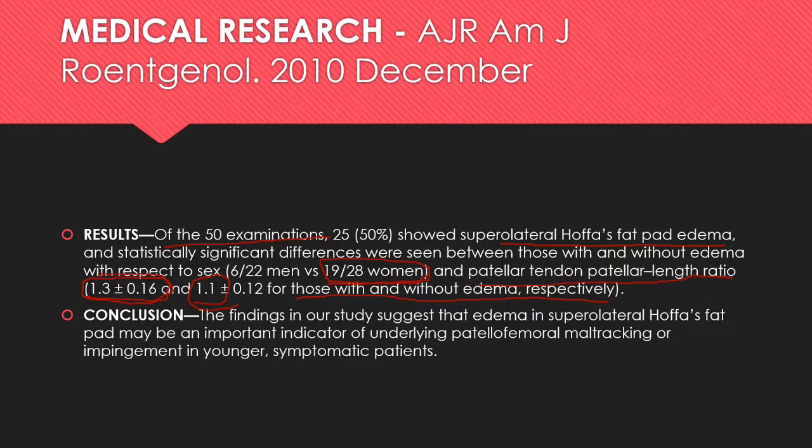And they concluded that the findings in our study suggest that edema in Hoffa's fat pad may be an important indicator of underlying patellofemoral maltracking or impingement in younger symptomatic patients. So here we have a study that shows that due to this anatomic configuration of a patella alta, this patella alta contributes and is associated with impingement of Hoffa's fat pad.